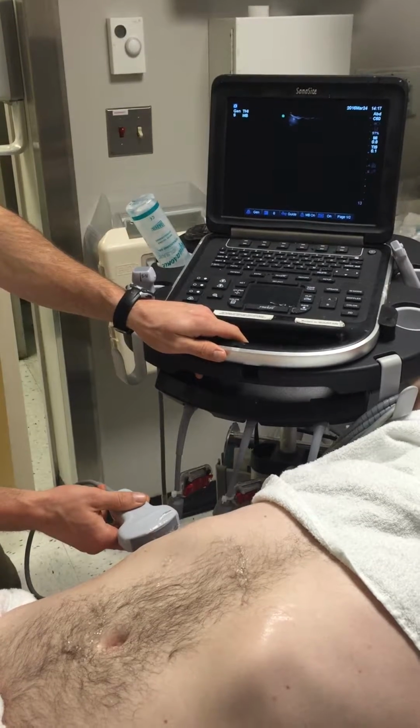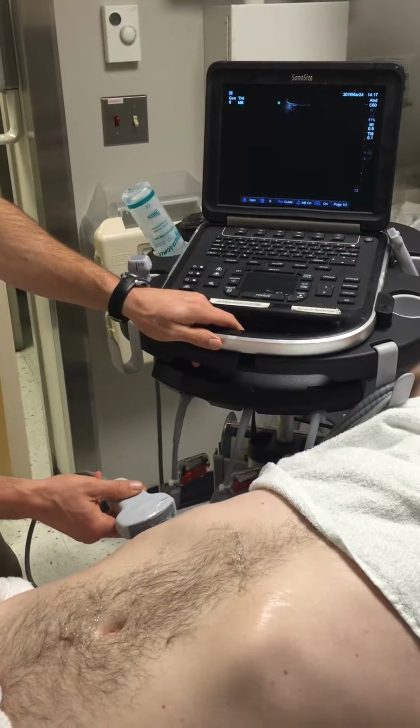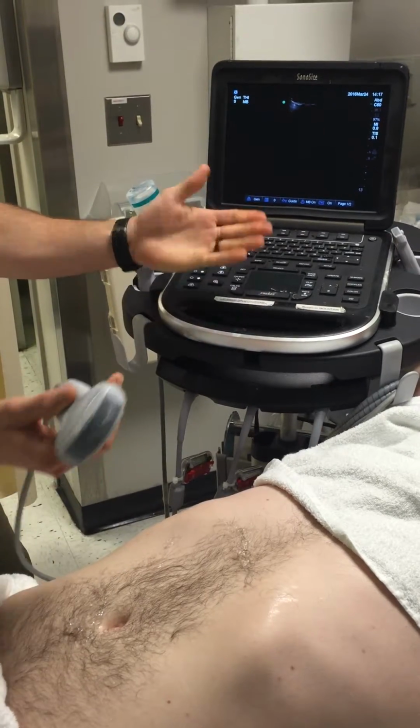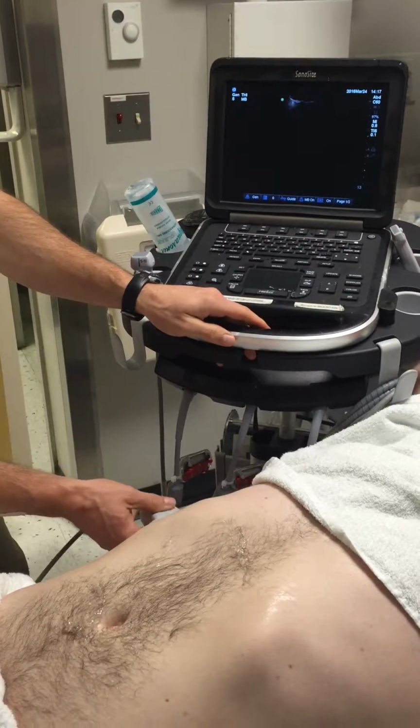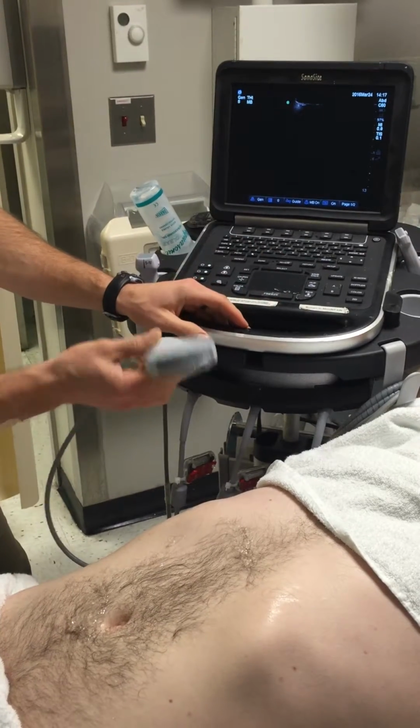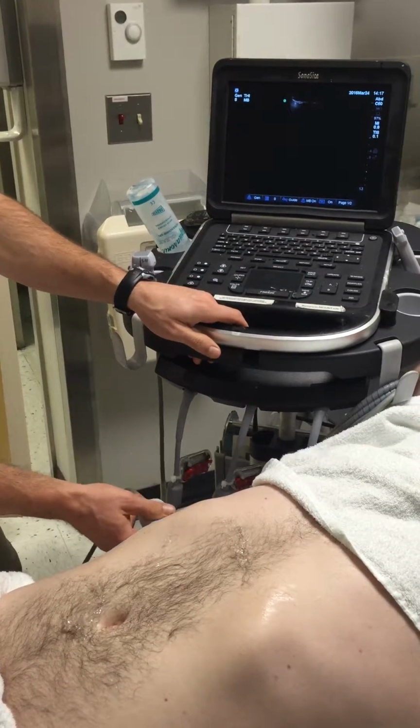Today we're going to review image acquisition for renal and bladder. So typically you'd start on one of the sides. Most patients come in with flank pain, and so we'll start here at the right flank. And I have the indicator towards the patient's head. And typically I start in long axis of the kidney.